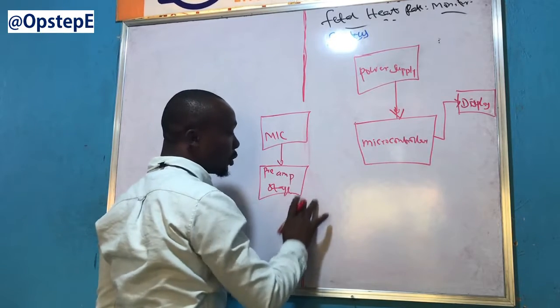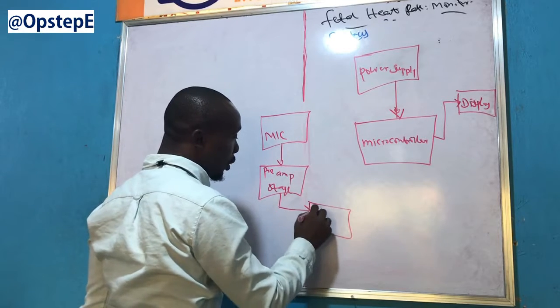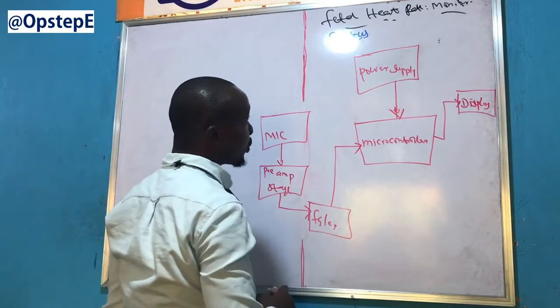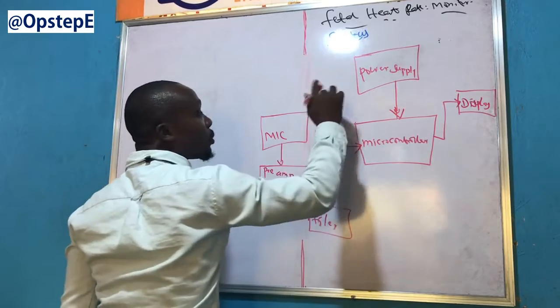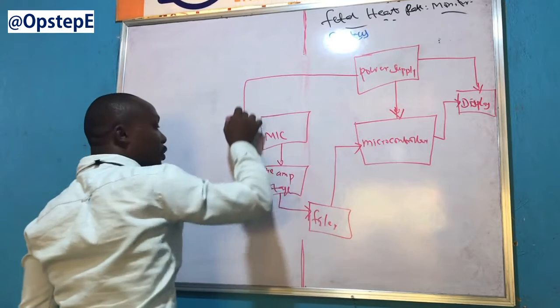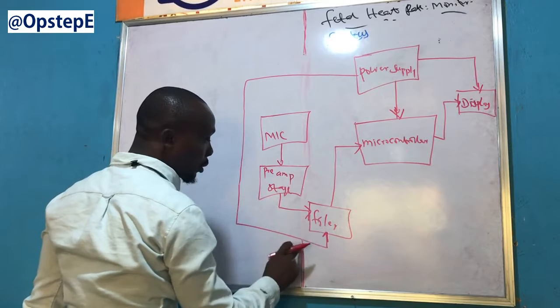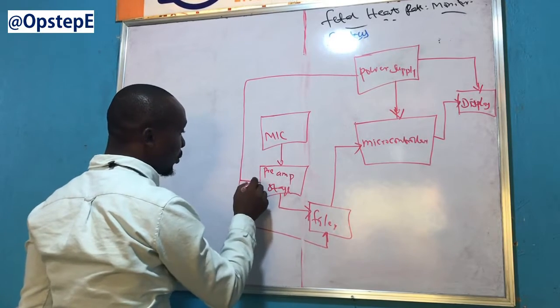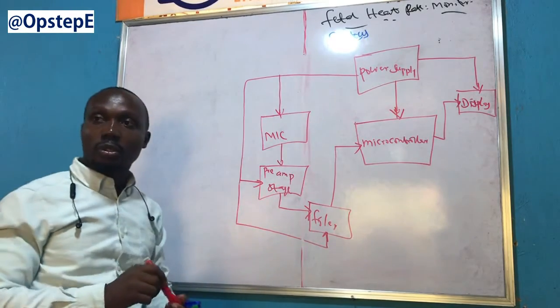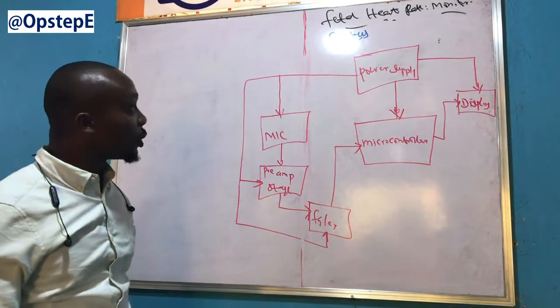and then from the preamp stage it should go into a filter, and then from the filter it should feed the microcontroller. Power supply should be made available to the display in question, so power supply is made available to all of the blocks needed to complete the project. So here's the block diagram.